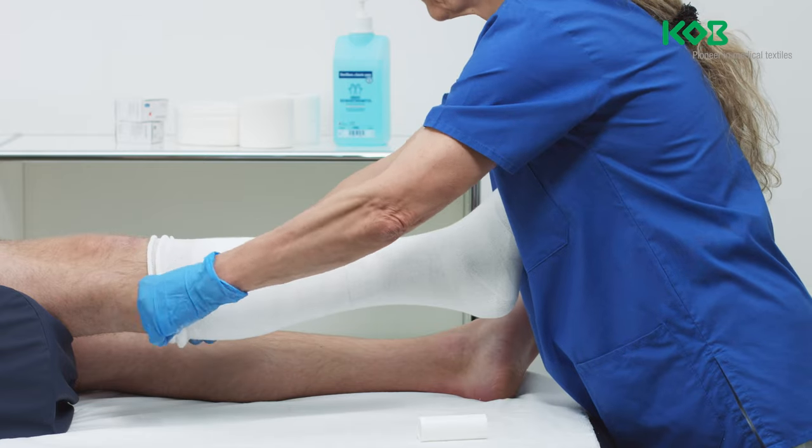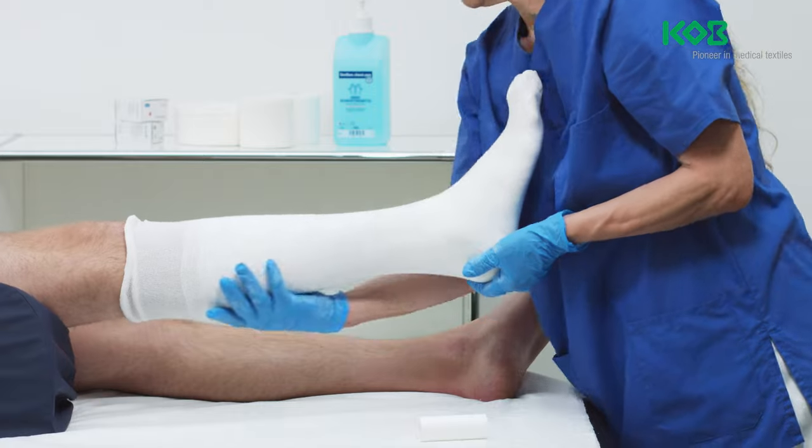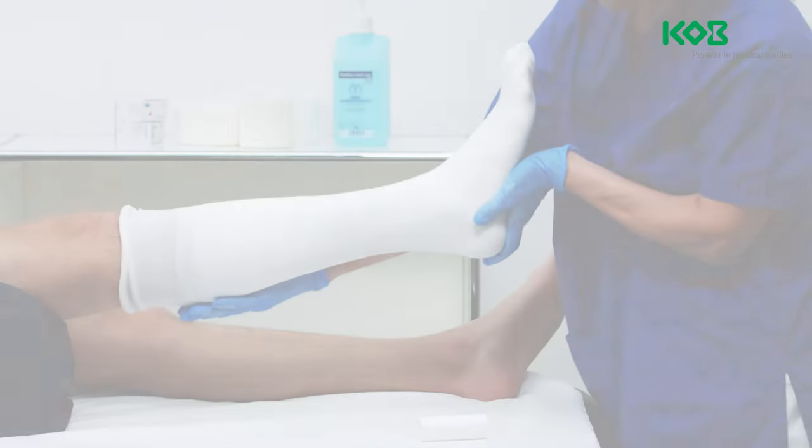Be aware that it may be necessary to adjust the application technique to suit the anatomic and pathophysiological characteristics of the patient.